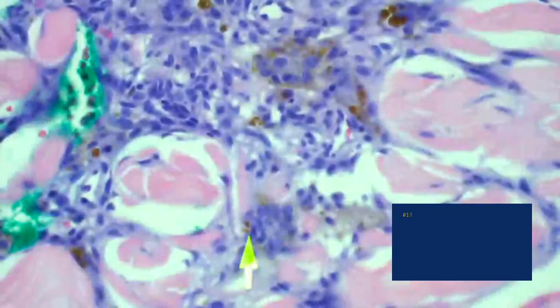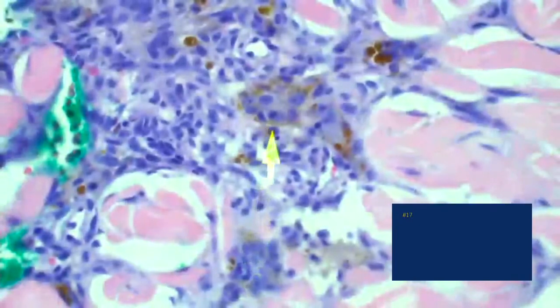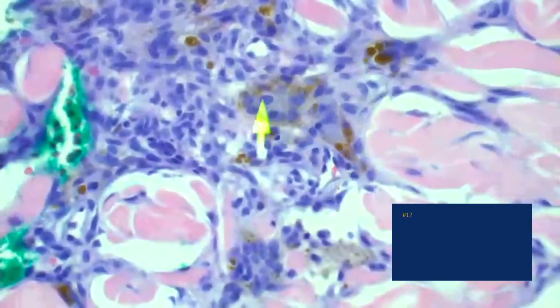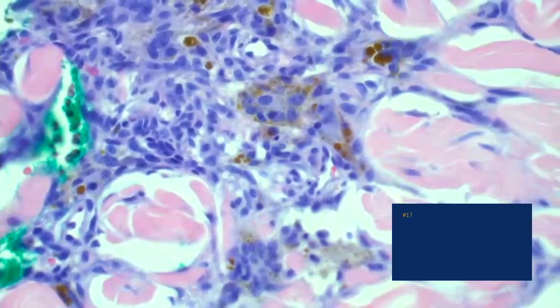What kind of cells do you think they are? I think they are probably fibroblasts. Yeah, good. Some of them are fibroblasts. Some of them are probably histiocytes. That's maybe a multinucleated histiocyte there containing this hemosiderin in it. Mm-hmm. And then you've got this kind of changed collagen here. Collagen trapping. Yeah, these collagen bundles. So what's the diagnosis? Hemosiderotic, yeah.